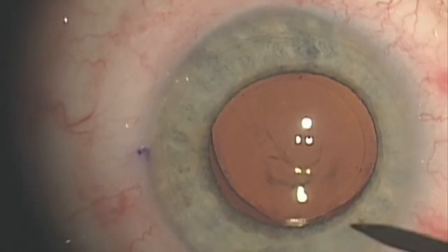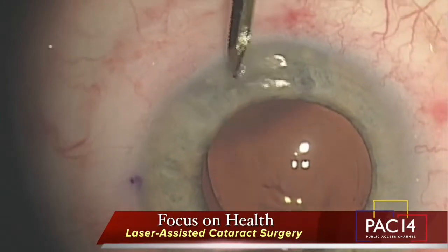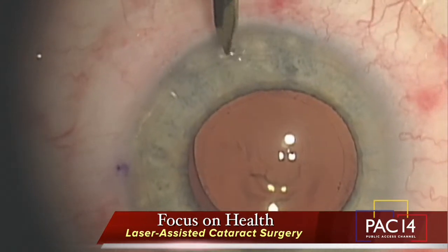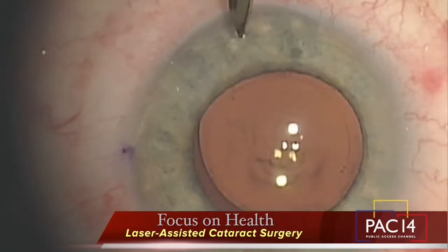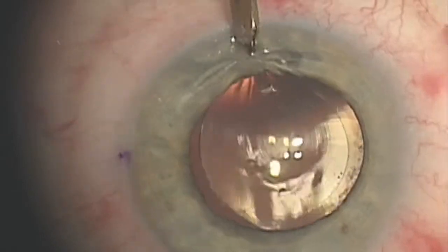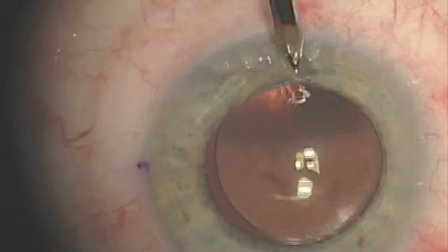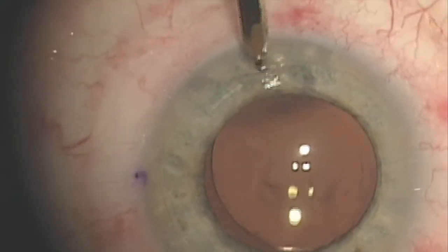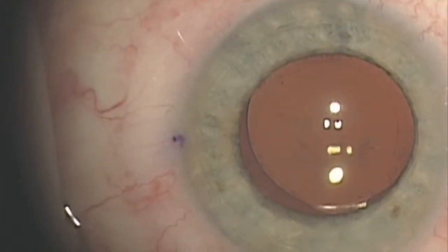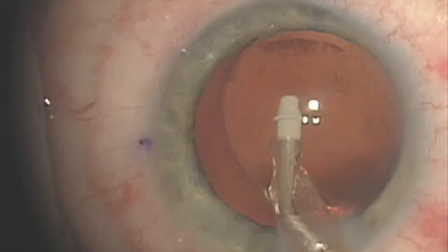I'm going to take out that thick goopy stuff after I open the arcuate, as Carly and Becky kind of have to remind me. Over here, we can see our arcuate. So we're going to open that right up. That is the part that was created by the laser, correction of astigmatism. Just trying to make sure we got it all. See how the circles are in there, that multifocal. I'm going to take out that thick goopy stuff.